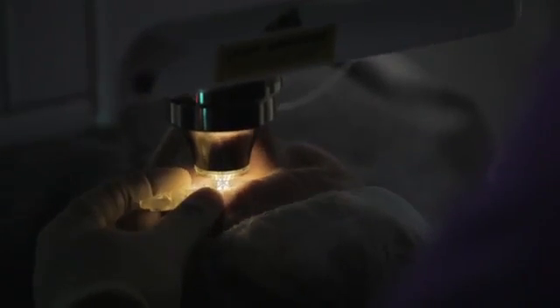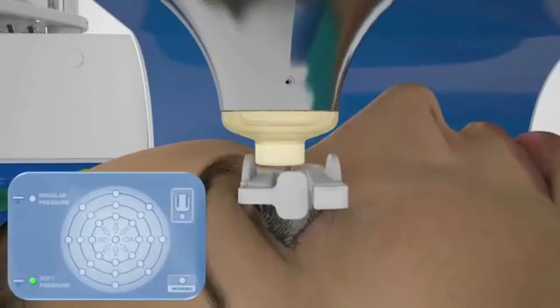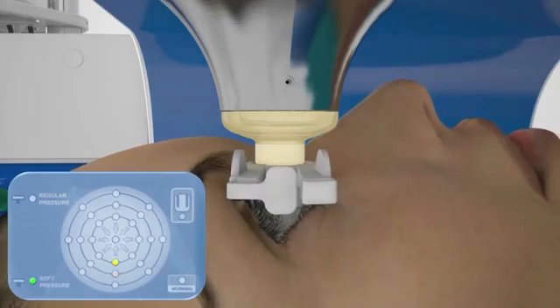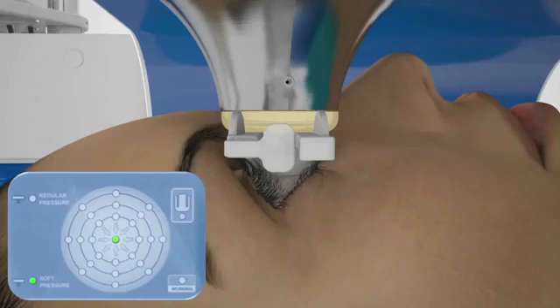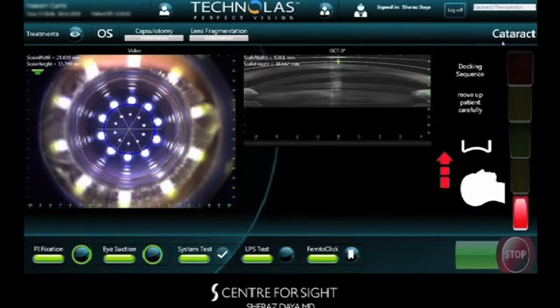The VICTUS femtosecond laser performs surgery at 80 kHz and uses a curved interface with soft docking and intelligent pressure sensors to monitor forces in 3 dimensions. This reduces corneal deformation and wrinkles, which can affect performance and accuracy of the laser. The laser images the anterior segment using online high-resolution optical coherence tomography as illustrated.